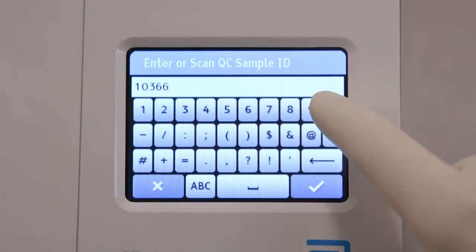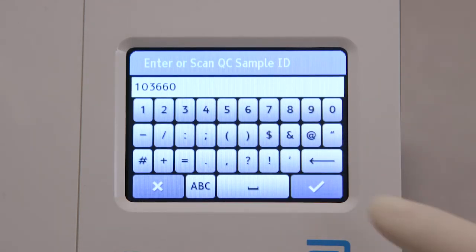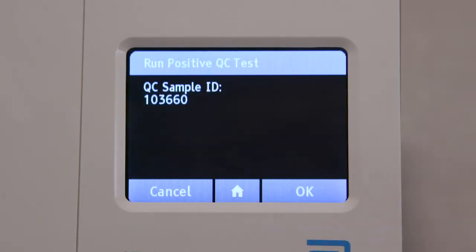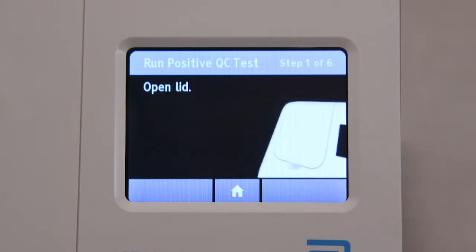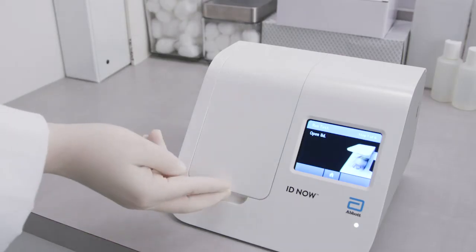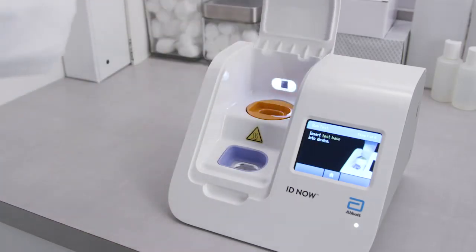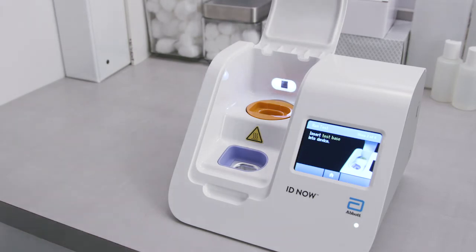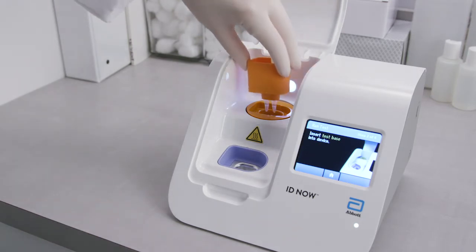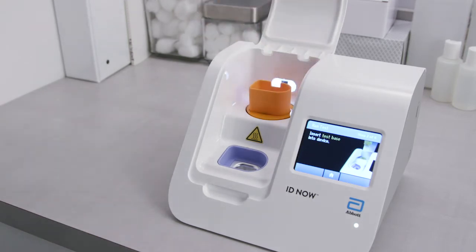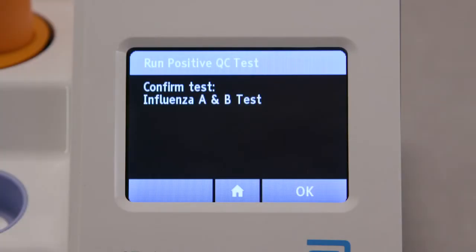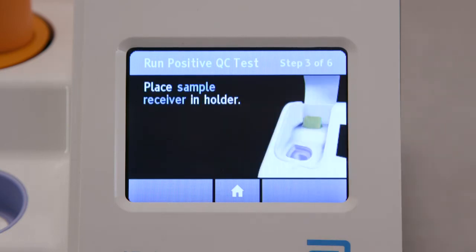The QC test will be run in the same manner as a patient test. When prompted, open the instrument lid. Insert the orange test base into the orange test base holder. Confirm that the correct test is displayed on the screen, then touch OK to proceed.